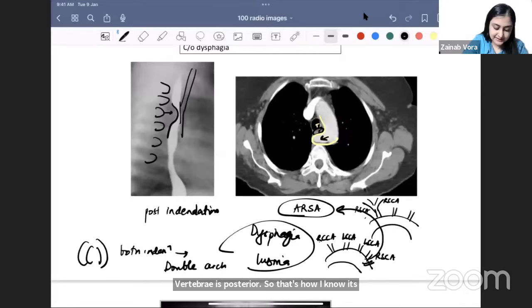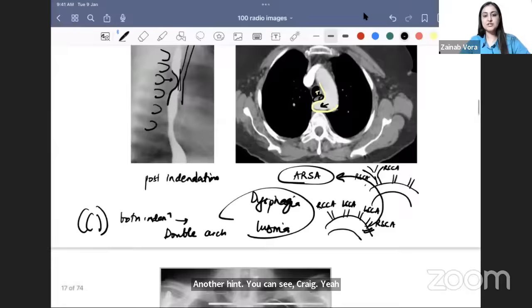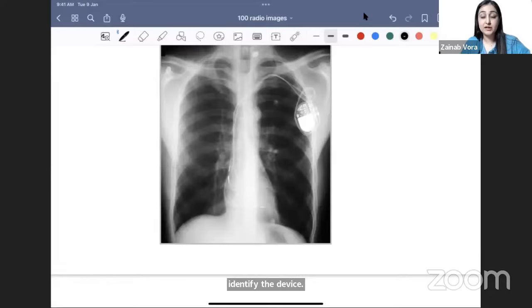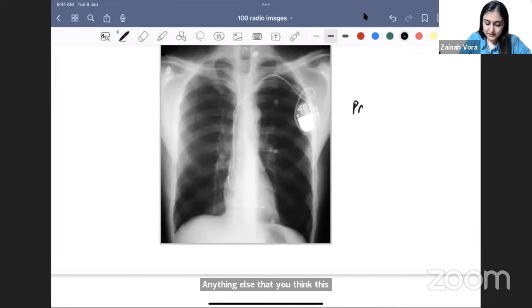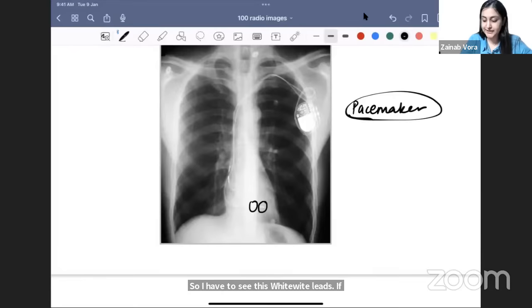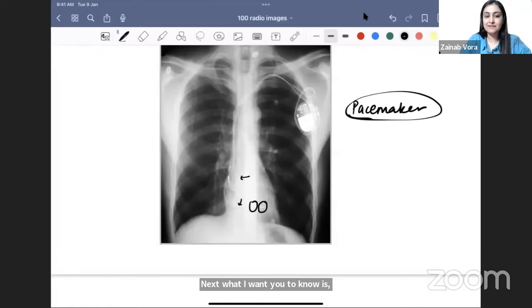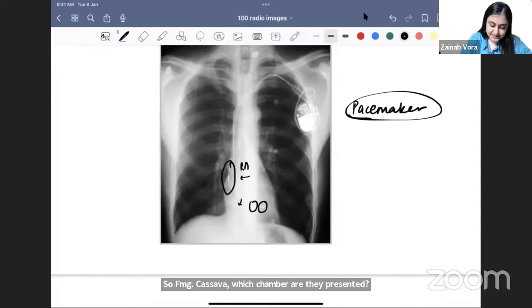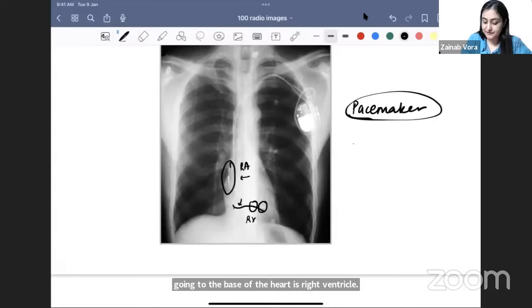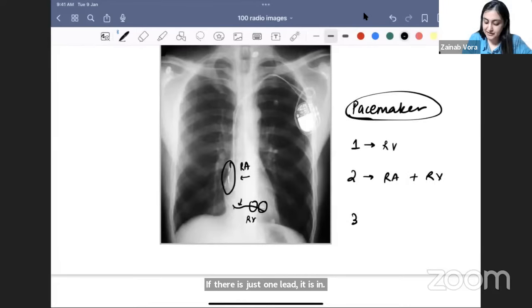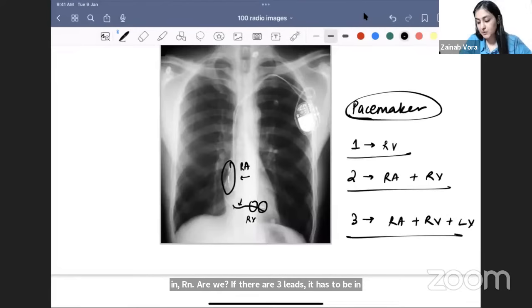Identifying the device on chest X-ray: this is a pacemaker — the white leads are very small. To know which chamber the leads are in: if the shorter lead goes upward, it is in the right atrium; the longer lead going to the base of the heart is in the right ventricle. One lead = RV; two leads = RA and RV; three leads = RA, RV, and LV.